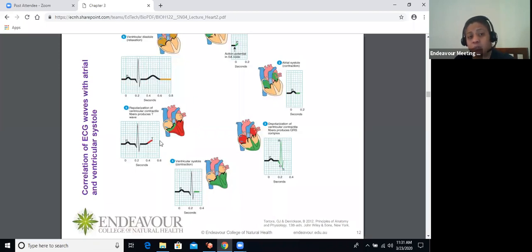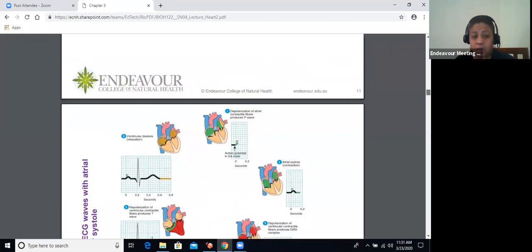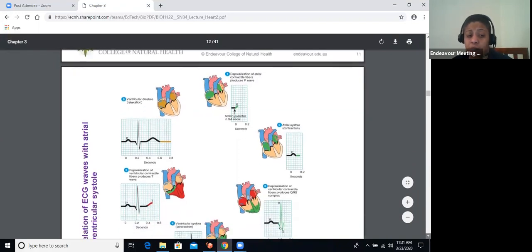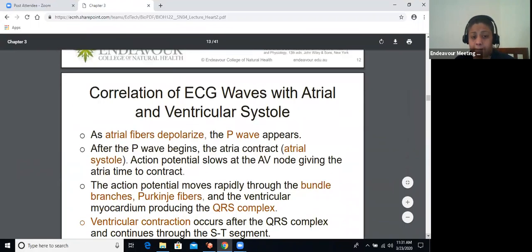In other words, the T wave is the time taken for the ventricles to fill up with blood again. Then you have the completion of the T wave. This is when the AV valves open in the cardiac cycle and allow the blood to flow into the ventricles. You will have to use this concept of the cardiac cycle in answering some of the questions related to your lab.